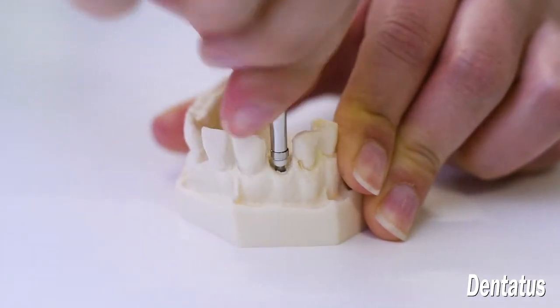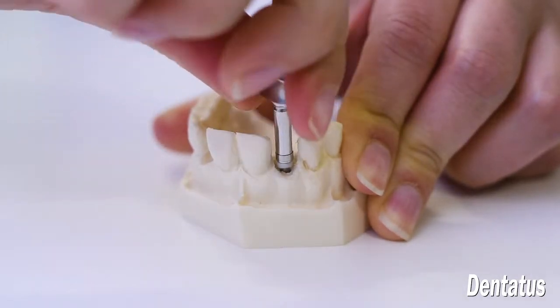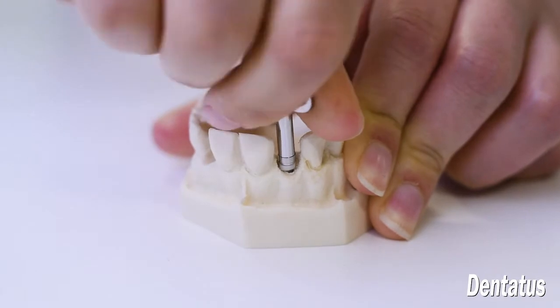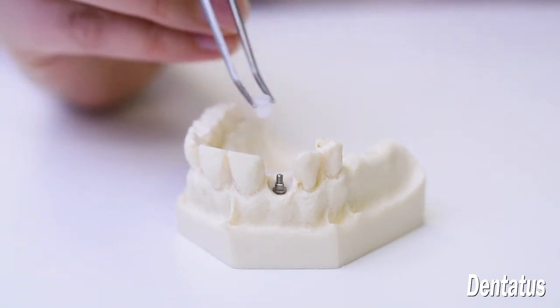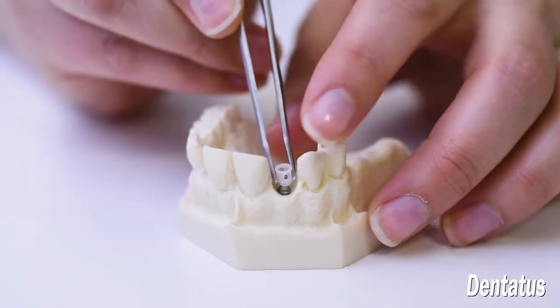The gingival spacer remains on the implant to prevent the crown from locking on. The essential consideration is that the platform is seated at or slightly below the gingival level for optimal aesthetics. With the gingival spacer tightly in place, the resin index platform for temporary crowns is seated on the implant platform.